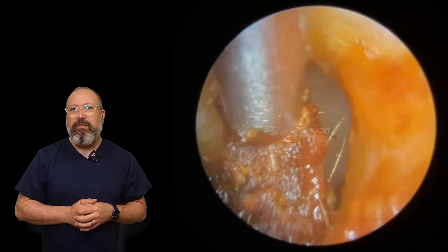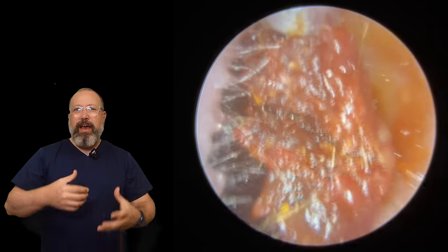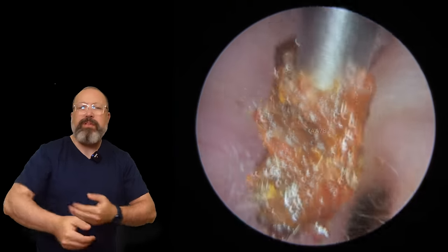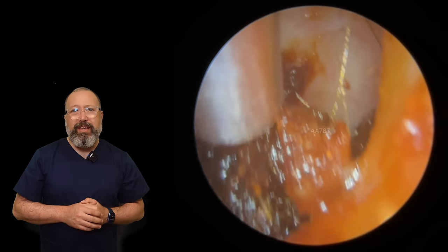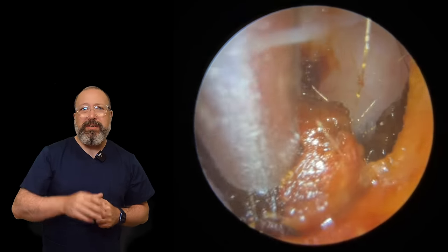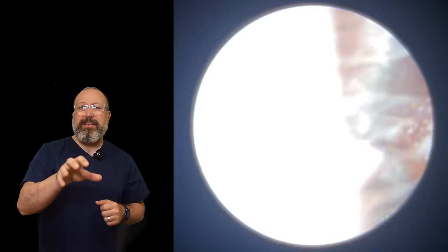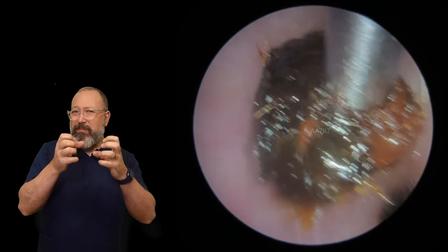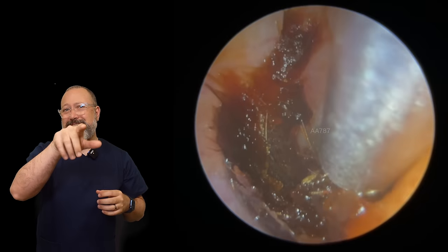You can see it start to come forwards, but as we roll this wax down the canal it arrests on the next part of the canal — it's sticking, a really juddery movement. Beyond this wax I can see a section stuck right down on top of the eardrum. You can see how sticky this type of wax is, which means that wax is going to be stuck to the eardrum down there.